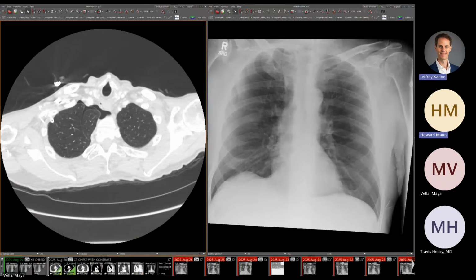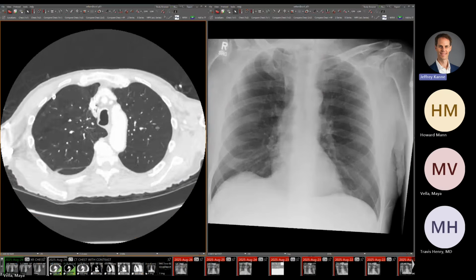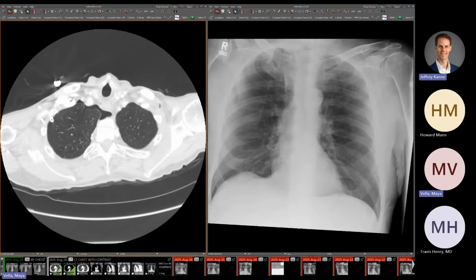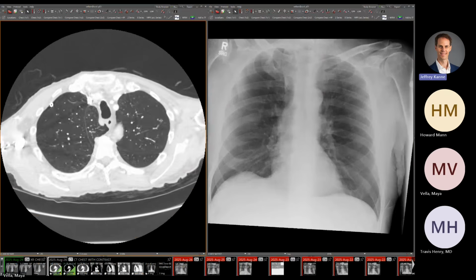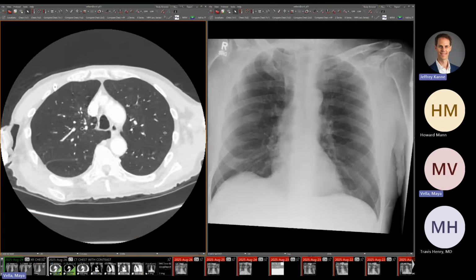I've also seen an empty azygos fissure with the azygos in its normal location, with no history of pneumothorax or surgery or anything. So maybe embryologically during development, it pops out. Yeah. But it just illustrates the point that the vein is technically not in the pleural space, right? Because it's extra pleural.